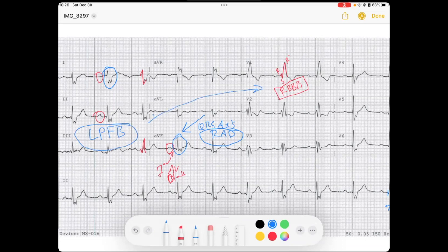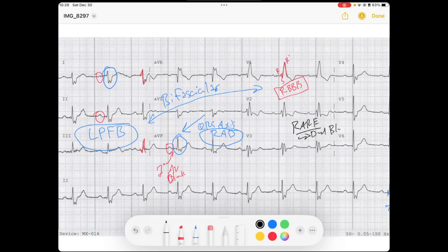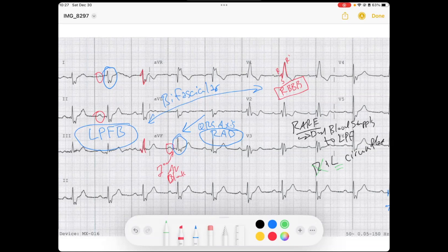So this is a bifascicular pattern of block. The right bundle branch block plus left posterior fascicular block is more rare because the left posterior fascicle actually has dual blood supply — from both the right coronary artery and the left circumflex. If there's disease in one, the other can still provide good collateral flow. So we don't see this combination very often, and when you do, it may be evidence of more extensive structural or ischemic heart disease.